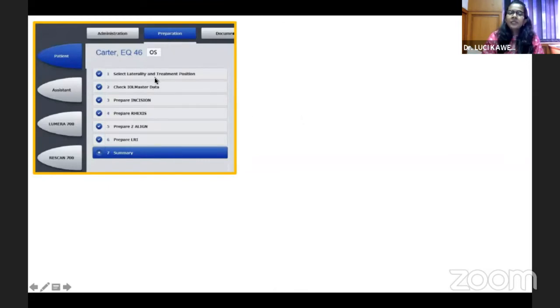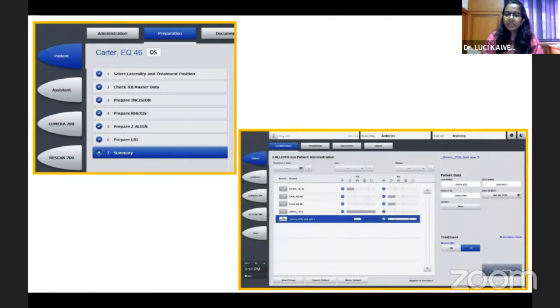In the patient preparation step, you can add further details — confirming the eye, checking the IOL Master data, scan quality, and IOL power. You can prepare your incisions based on the axis you intend, whether a temporal incision or adjusted slightly superior or inferior based on the astigmatism. You can mark your axis and centration, verify everything in the patient summary, and then click the start treatment option just before beginning surgery.